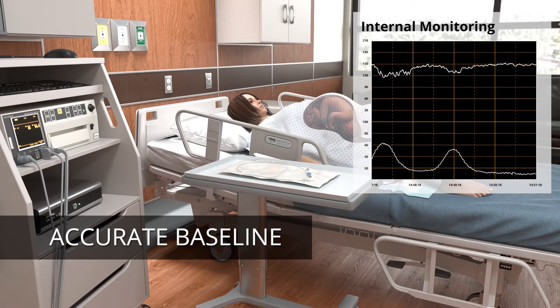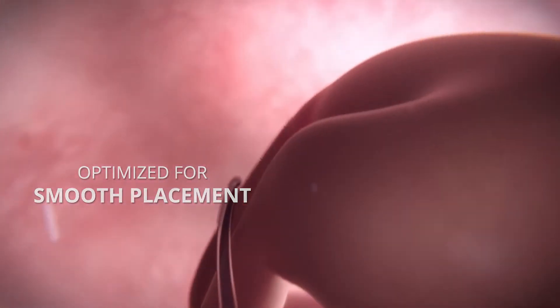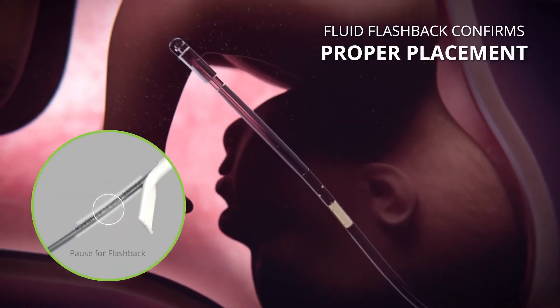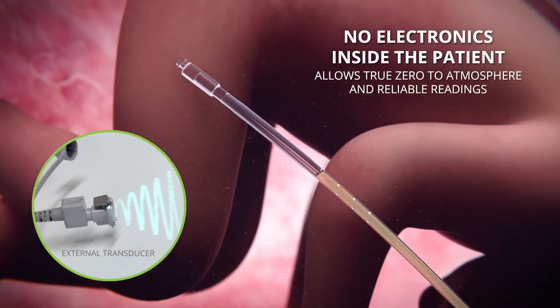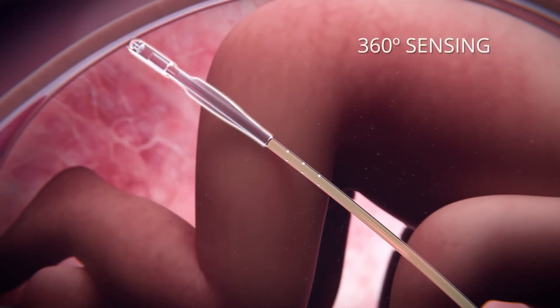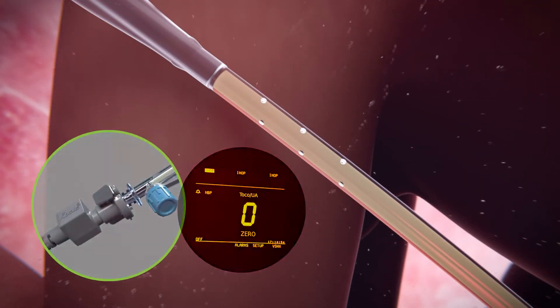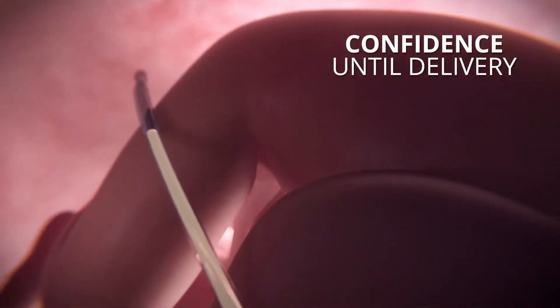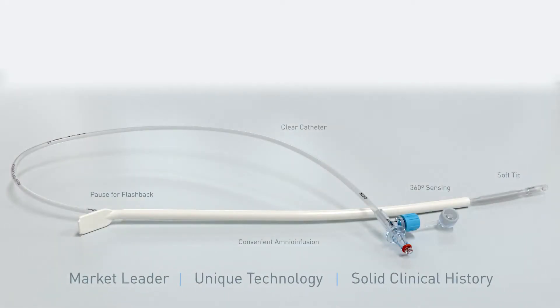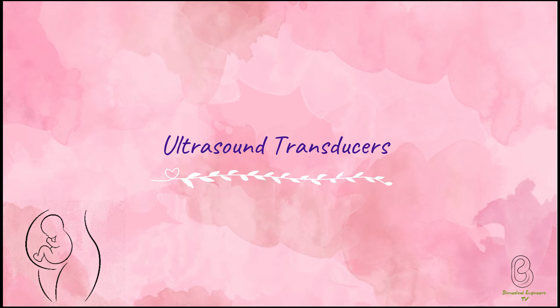The second type of transducer used in measuring intrauterine pressure is the IUP transducer. An intrauterine pressure catheter (IUP-C) is a device placed into the amniotic space during labour to measure the strength of uterine contractions. External TOCO dynamometers detect only contraction frequency and duration, and the appearance of contractions may be affected by contraction strength, maternal habitus, position, gestational age, and monitor location on the abdomen.